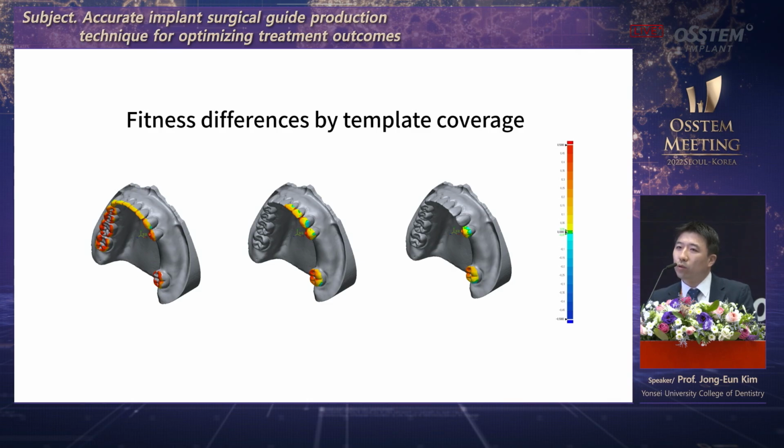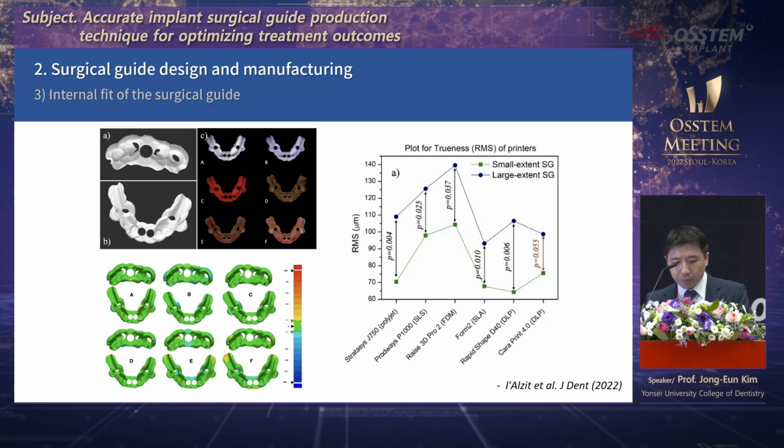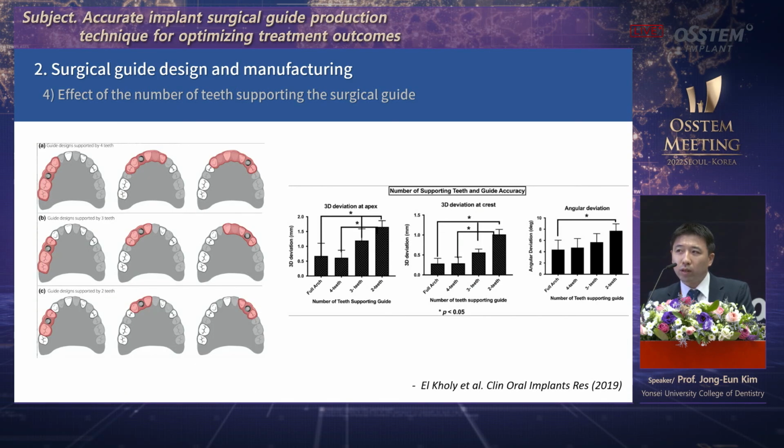When you do the experiment, if you narrow the scope, you can see that it's adapted in the designed way. As shown, this is a study done by my lab. In different groups, these results are repeated. If you make the scope shorter, you can adapt it better.